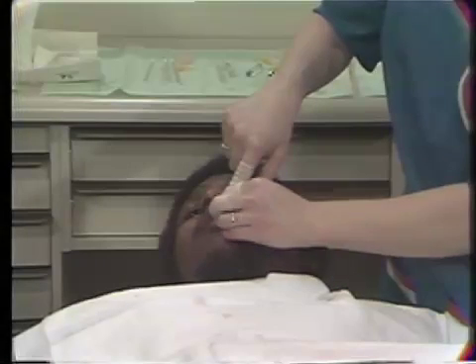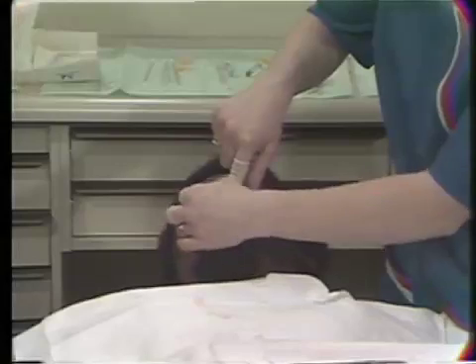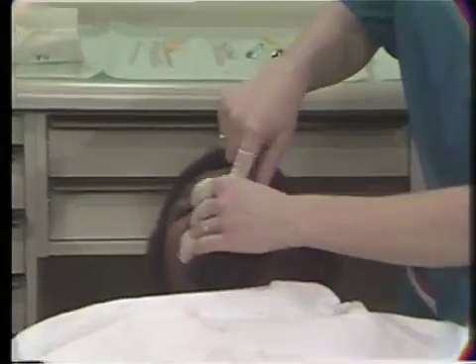Betty is now cleaning off the patient's face, both extraorally and intraorally. You can see how she's cleaning off the teeth because they do accumulate a lot of red material on them. And she cleans around the face, even way around on the right side sometimes. My hands get as far back as the ear with a little red material, so she cleans them up very well.